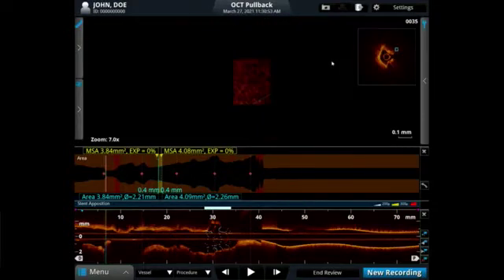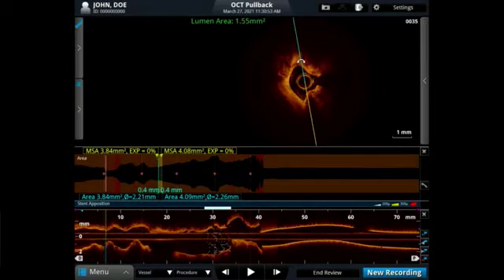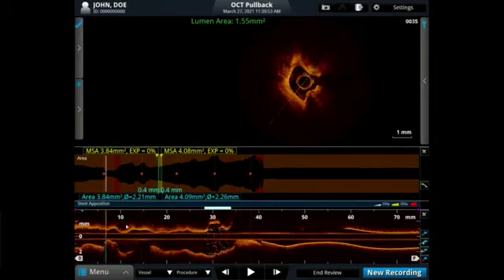If I spin my axis, my camera, and you look down here, you almost take the lesion out because you're cutting through the longitudinal axis of the oval. If you go this way, you see that the lesion is tighter. However, I never rely on this OCT longitudinal 2D view. I always go by the 3D reconstruction because it's telling you there is definitely a tight lesion here. And here we go, moving forward, there's a big nodule here, a big nodule here.